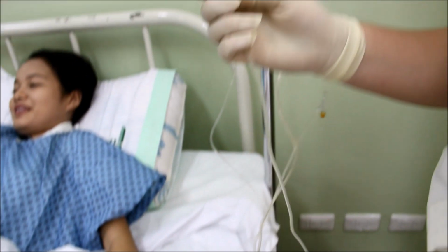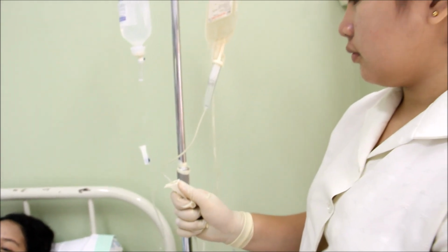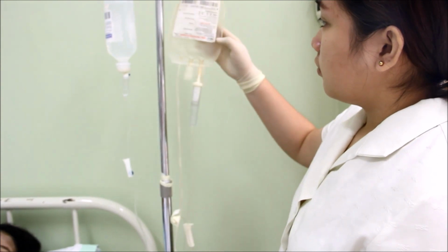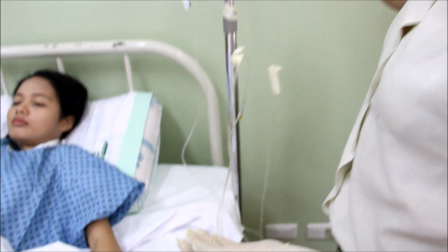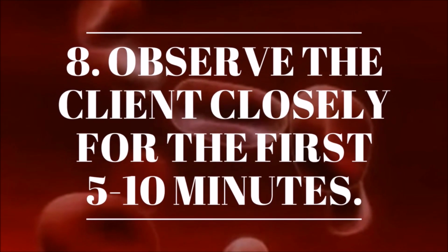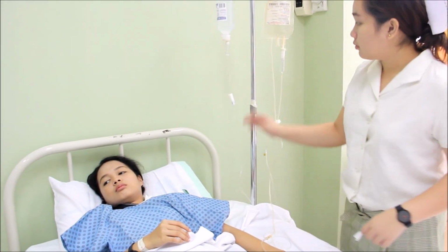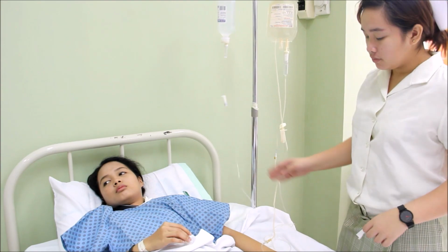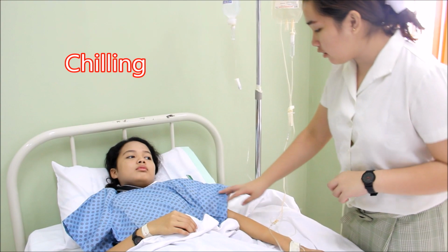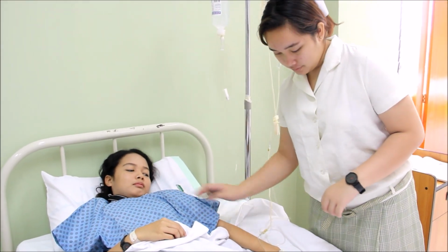Blood will run into the saline-filled drip chamber. If necessary, squeeze the drip chamber to re-establish the liquid level with drip chamber 1/3 full. Readjust the flow rate with the main clamp. Run the blood slowly for the first 15 minutes at 20 drops per minute. Note adverse reactions such as chilling, nausea, vomiting, skin rash, or tachycardia.